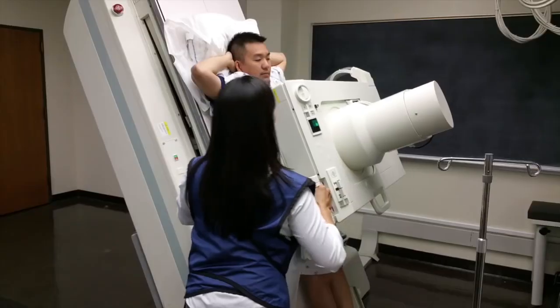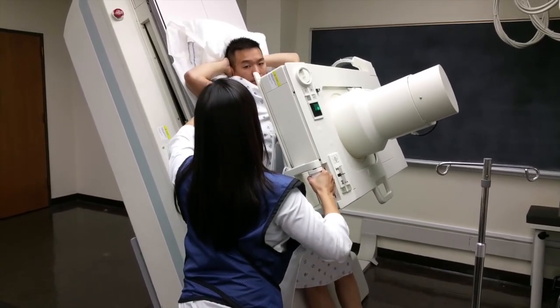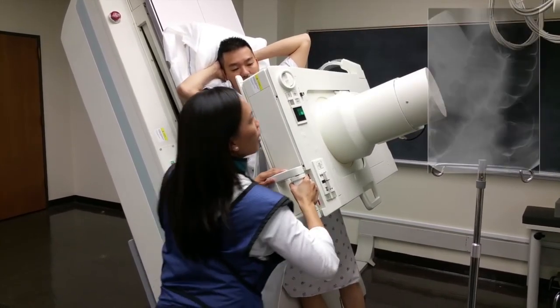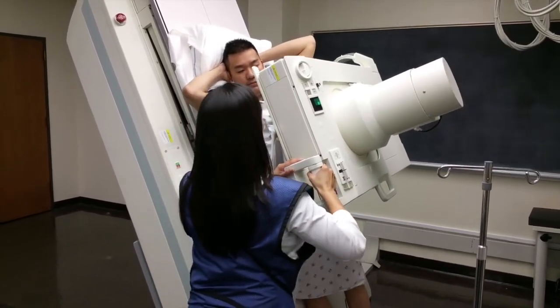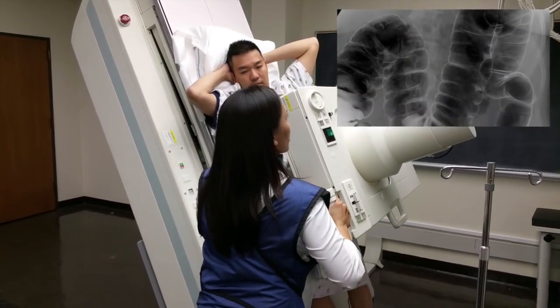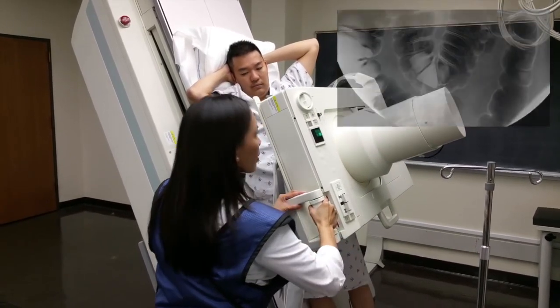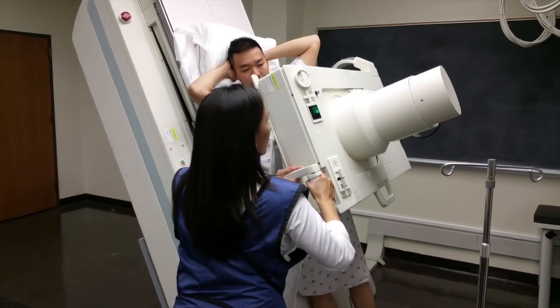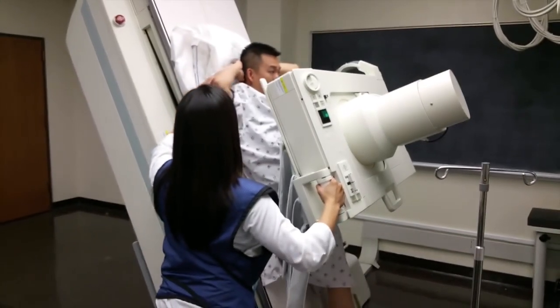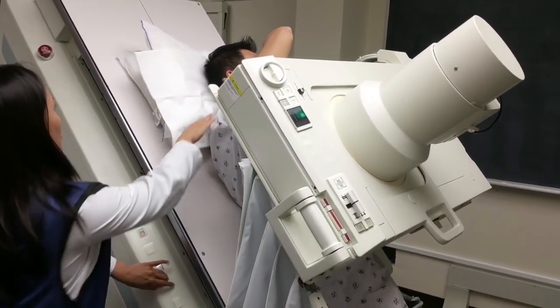To see the splenic flexure, oblique your patient with their right side down and the left side up in a right posterior oblique position. I usually bring the image intensifier down again to take a look at the ascending, proximal, and middle sections of the descending and the sigmoid colon to assess anatomy and take spot images. Once you have good images of the patient in the upright position, bring the table back to horizontal and do a quick overall scan in unmag mode.